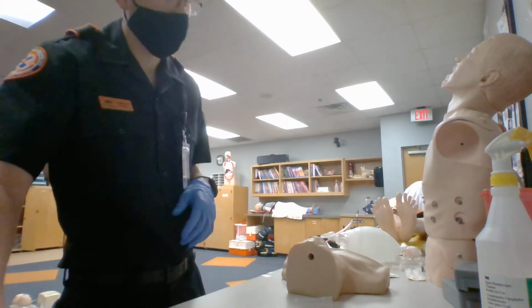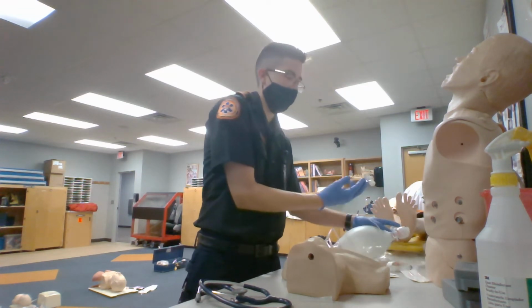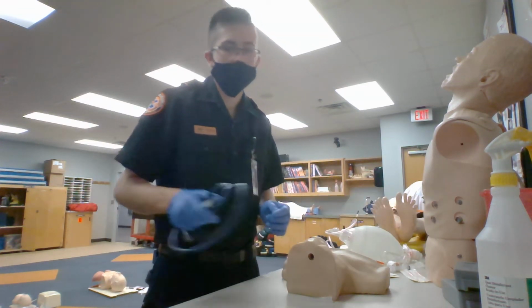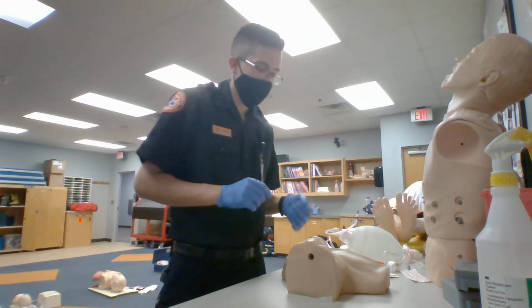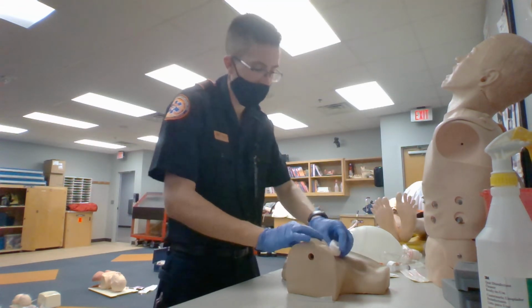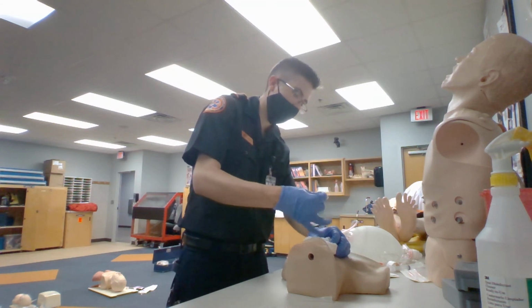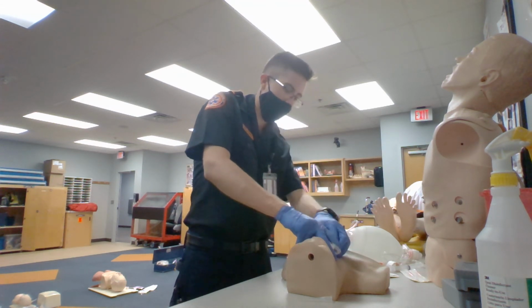I'm also going to do a secondary confirmation by connecting my BVM to capnography. I can also auscultate over both of the lungs and the epigastrium to make sure that I'm getting proper air movement. And so after I've confirmed proper placement, I'm going to come over and stabilize my needle with a bulky dressing.